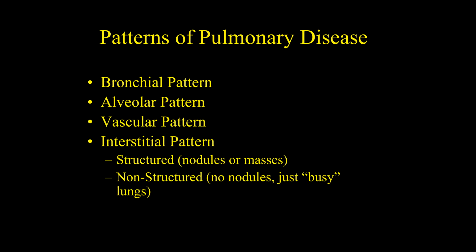So the first thing that we're going to do is, because it can be very complicated, and even a lot of referring veterinarians have a hard time learning bronchial patterns, alveolar patterns, vascular patterns, interstitial patterns, what constitutes what. It can be very confusing. And so this is Brian Poteet's We're going to make this as easy as possible kind of lecture and clinically applicable. So when you get out, you'll be able to use this from day one and diagnose things on radiographs. That's the goal. I'm not a believer at all in making things more complicated than it needs to be. I don't need to say fancy words to try to impress you guys. So we're just going to try to teach something that's very, very basic and very clinically applicable.